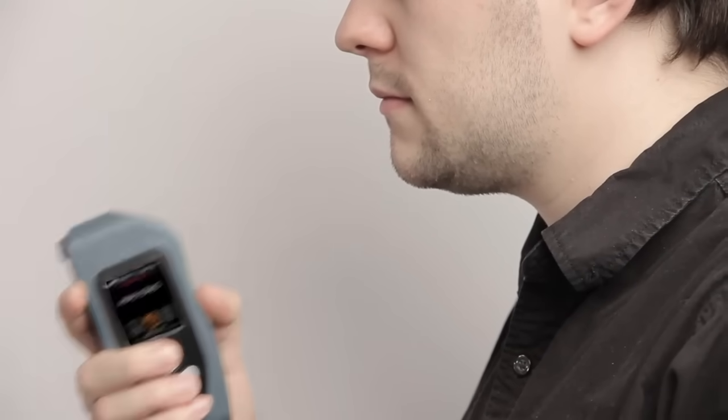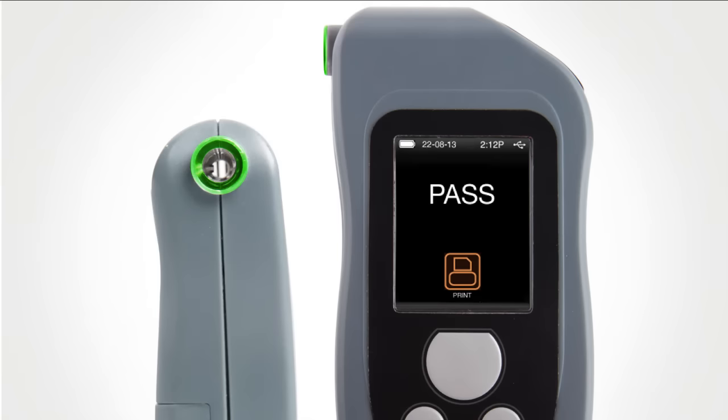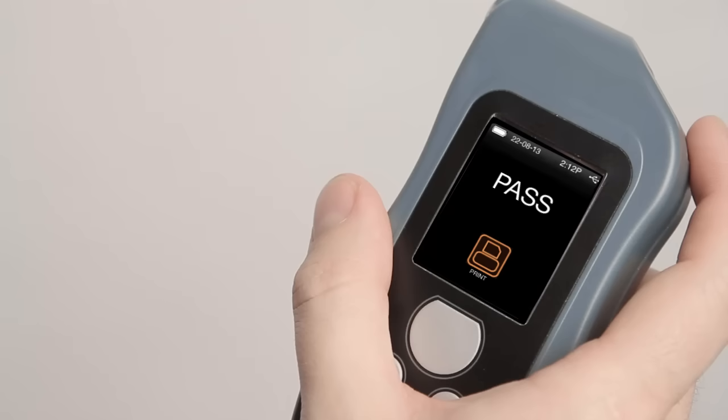Press the main button to take a sample. Analyzing is displayed for a few seconds, followed by a Pass, Warn, or Fail message and the Print icon on the display. If the printer is on and paired, select this icon to print the results immediately.